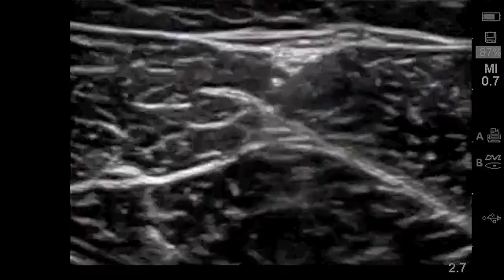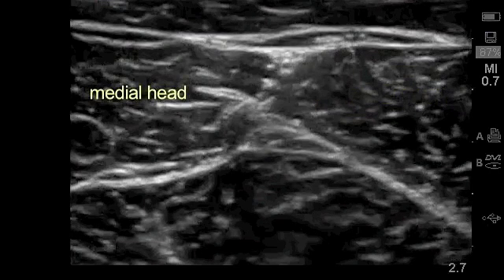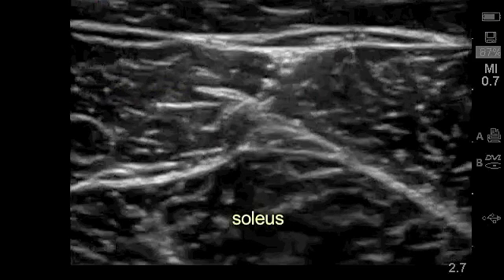In this normal volunteer, the medial and lateral heads of the gastrocnemius muscle can be seen in the near field, with the medial head on the left side of the screen. The soleus muscle is seen deep to these structures.